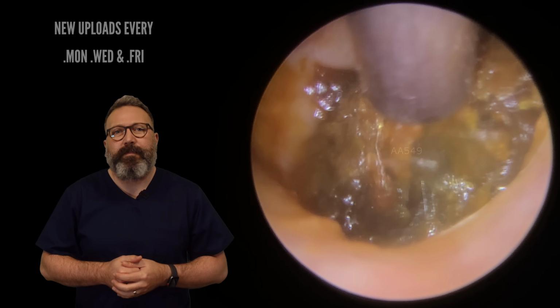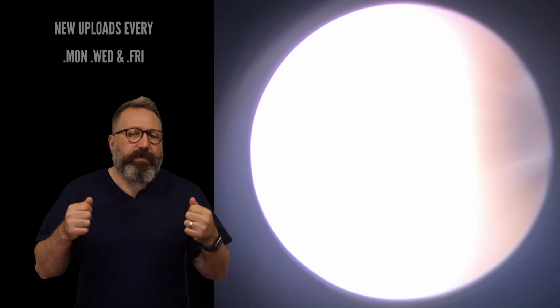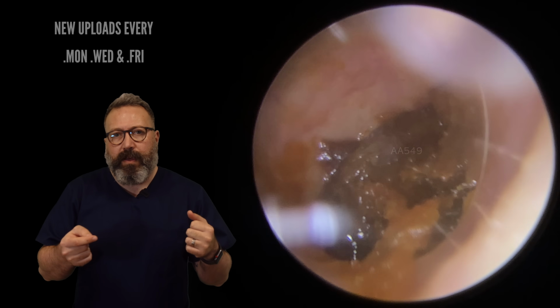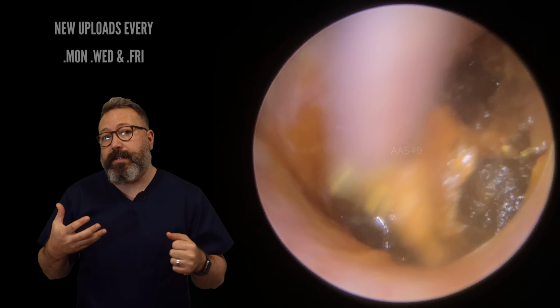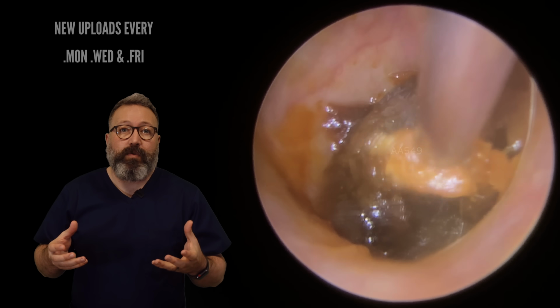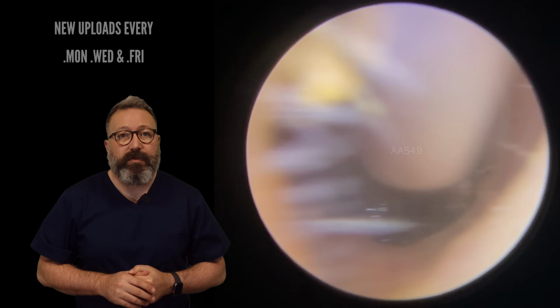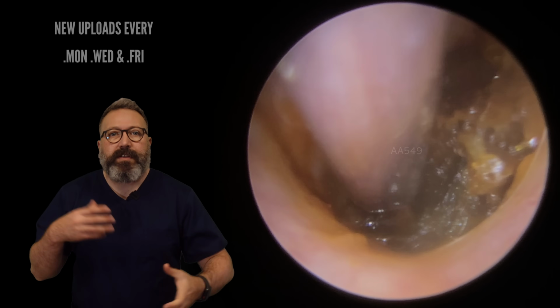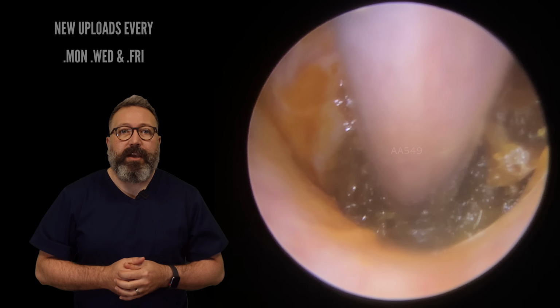So the patient was saying that they were in the shower one day, washing their hair, a little bit of water went inside their ears, and bump, they couldn't hear anything. I think what's probably happened is this plug was actually a lot further towards the outer part of the ear canal. Some water's got in and dislodged it from where it was sat on the canal wall, and it's actually gone further in, and that's what's happened here. So it was actually resting against the eardrum, this plug, and it's dried out over time, hasn't really shifted, and that's what's caused this blockage here.